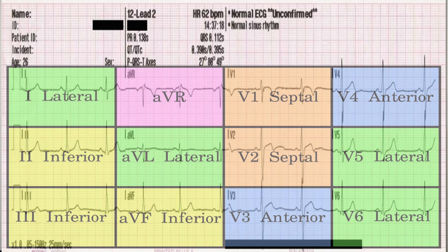When you look at the ECG trace, we split up the ECG into its various regions which allow us to identify inferior problems of the heart, septal problems of the heart, and lateral issues of the heart. So with that in mind, let's begin our ECG.